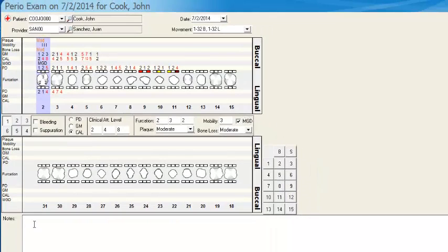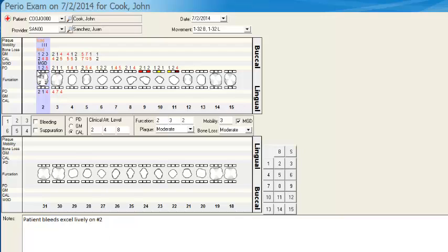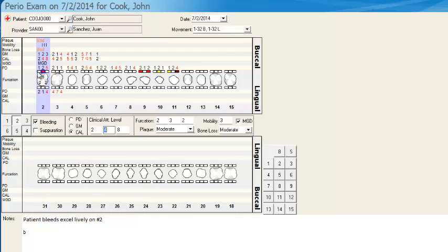At the bottom of the screen, you can put in notes. I'll paste in a note: 'Patient bleeds excessively on tooth number two.' If that's the case, you'd probably want to put some blood spots on tooth number two as well.